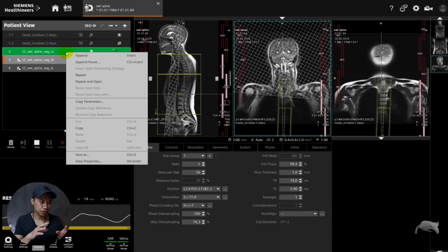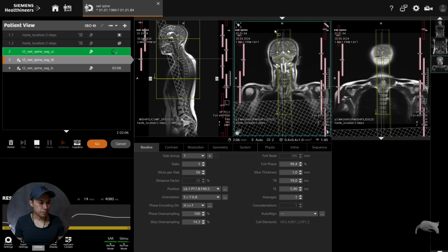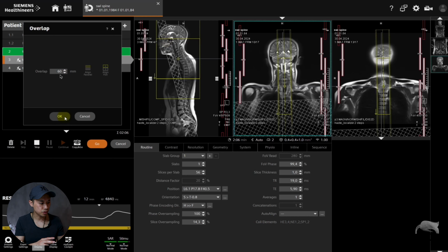For the thoracal part, I usually do it like this. I copy the previous step with cervical, so I have the position of that one, and then I go up here. I go and check, for that specific VIDA scanner it is 60 millimeters. So like this, I know it's 60, and then I push OK.